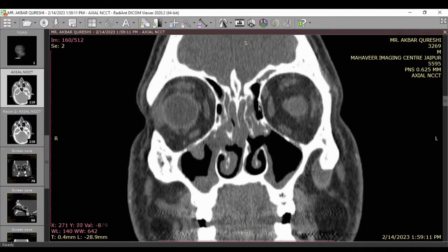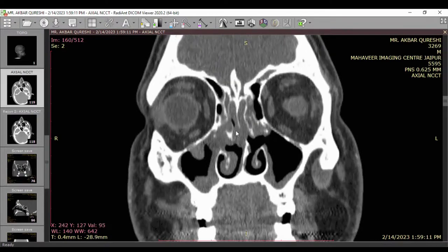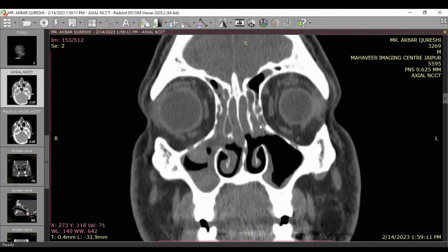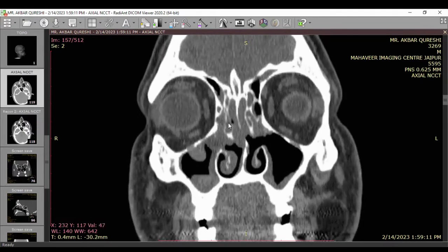The turbinate itself, can you see the entire length of the turbinate? It is pneumatized right up to the skull base. You have to deal with it very carefully, otherwise it can lead to fracture and CSF leak. See the entire turbinate lamella is pneumatized. See very clear? In contrast to the opposite side, the upper lamella is absolutely clear, and this lower one is pneumatized, concha bullosa. I hope you appreciate what I am trying to say. This is a lamellar cell, and this is concha bullosa.